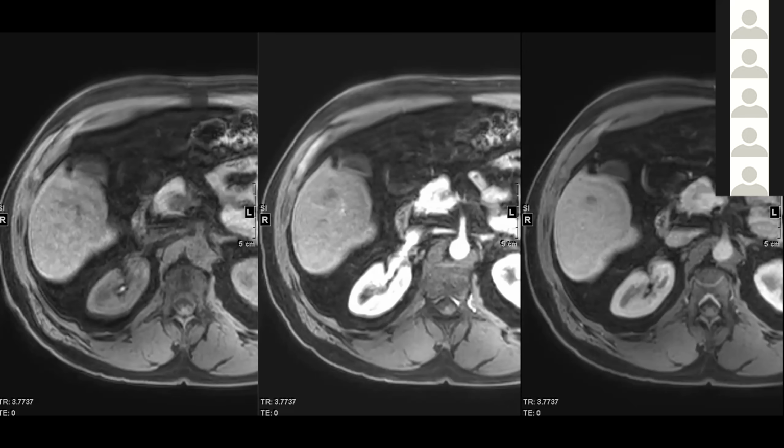Well, the change in definition is driven partially by this. I can bring up the curves and show you, but what we're trying to do right here is reconstruct the washout, the enhancement curve. Since we don't have the actual perfusion data, we basically use 2-3 time points with liver as a baseline.